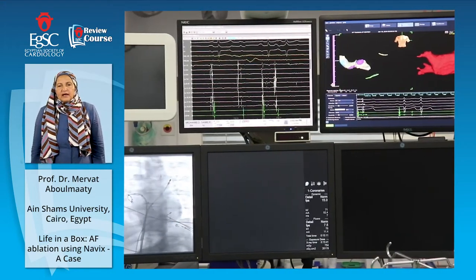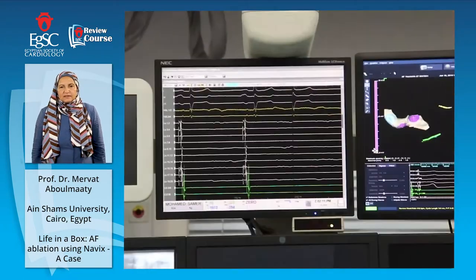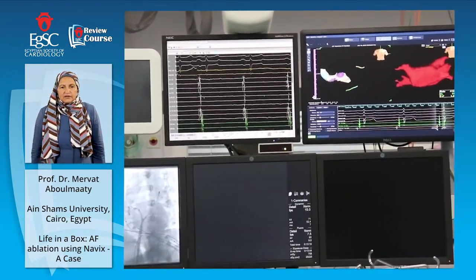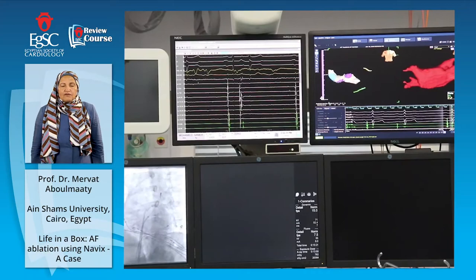Look with me, we have the map, the virtual map is beside the CT image. I place the CT image and now I go inside the veins by the circular catheter in order to get potentials and to make anatomical map of the whole structure.